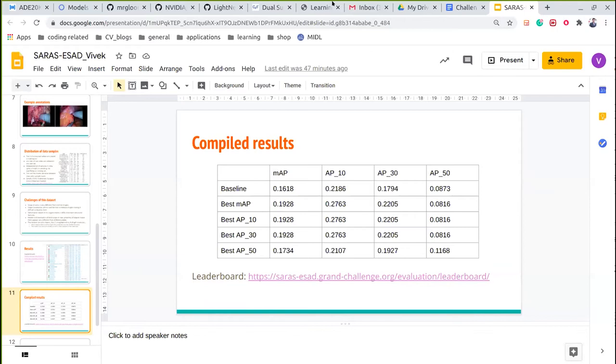And the other reason is that we want to propose a new additional benchmark for action detection to the computer vision community, which has largely been using two standard benchmarks, UCF-101 and J-HMDB-21, where videos are taken from YouTube or movies or other sources over the internet, but they don't really present the same kind of challenges as surgical videos do, and those that Vivek just explained in his presentation. So we think this new dataset can provide a complementary challenge to that of currently accepted standard benchmarks in action detection.